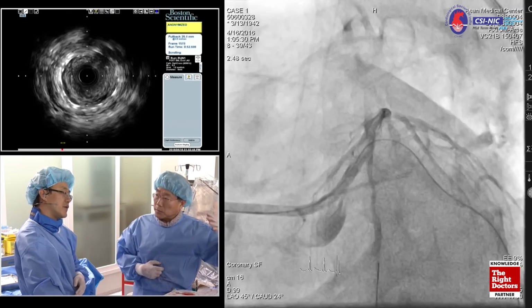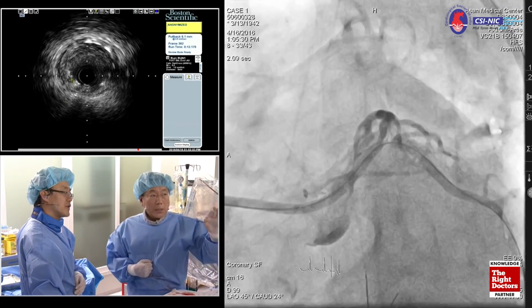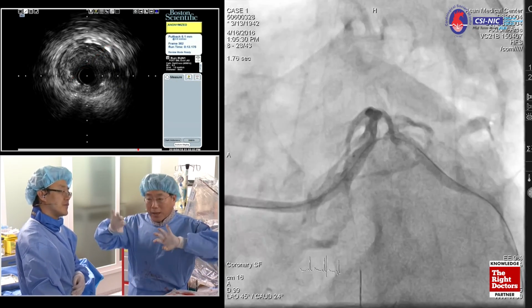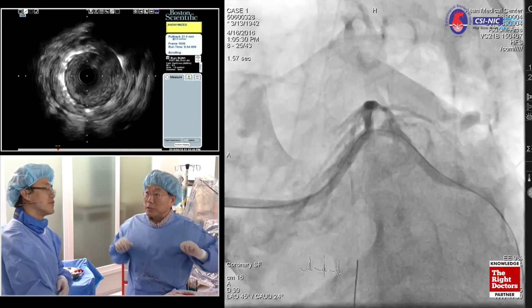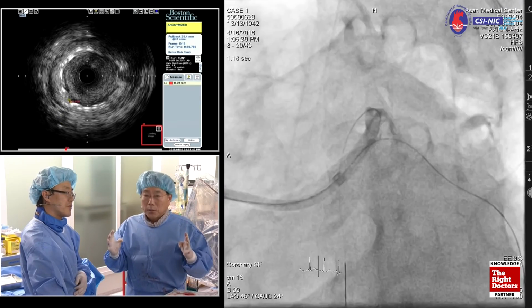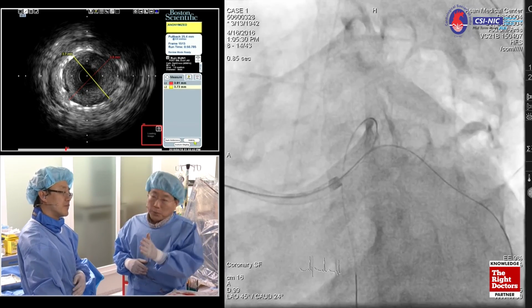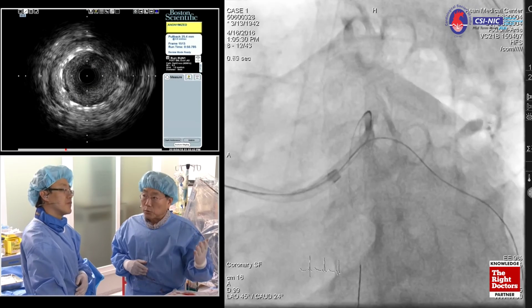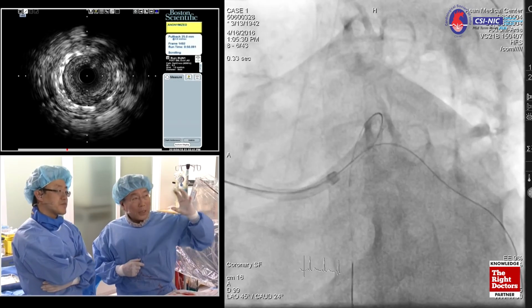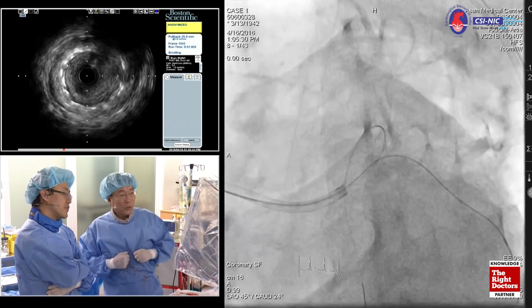So for the distal part, we need a higher pressure balloon, a little bit bigger non-compliant balloon. And then, if possible, why not use cutting balloons, for more even plaque breakdown and even redistribution of plaque. However, we cannot demonstrate any small difference between the cutting balloon and plain balloon angioplasty before any procedure for ISR lesions. However, still, if you look at some angiographic findings, I prefer a cutting balloon.